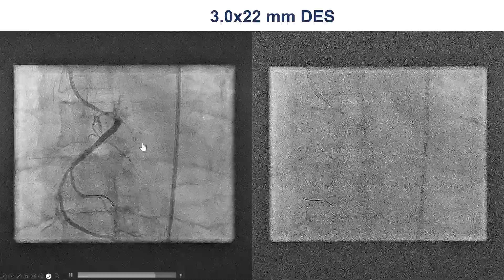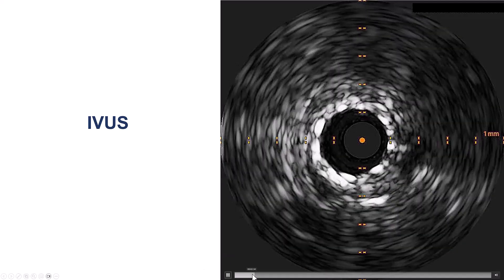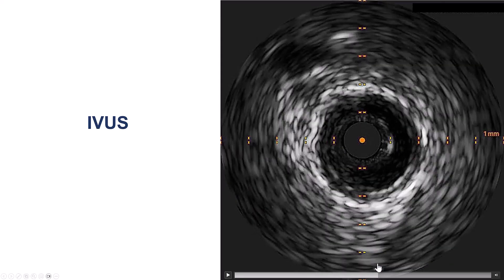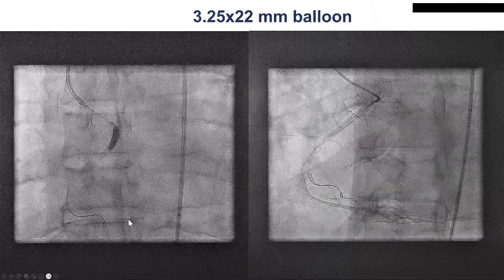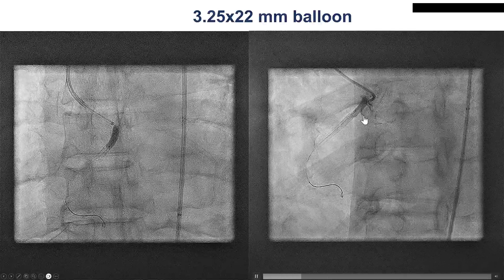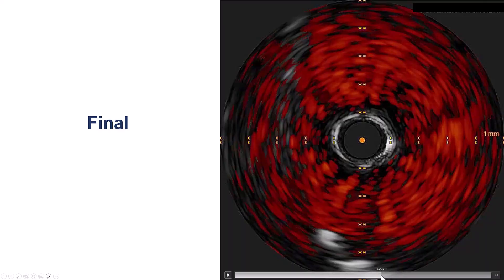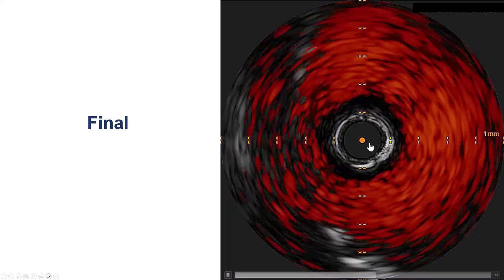However, we did want to confirm a nice result. We had difficulty delivering, but eventually we were able to advance an intravascular ultrasound and we do have good stent expansion. Coming back towards the aorta, the catheter was quite engaged, so we did a little post-dilation on the proximal part of the right coronary artery with a 3.25mm NC balloon. And this is the final IVUS using chromaflow — going from the aorta into the RCA — and we do see that we have nice osteal coverage of the right coronary artery.